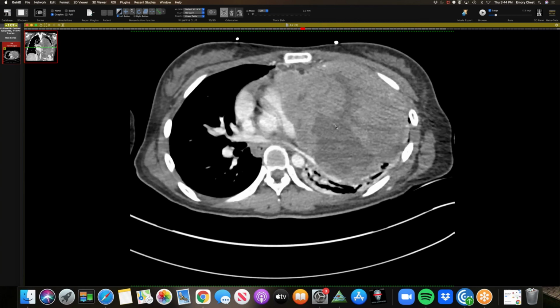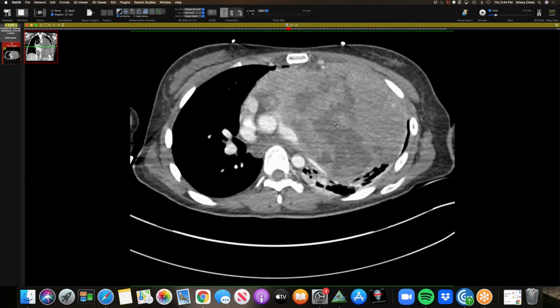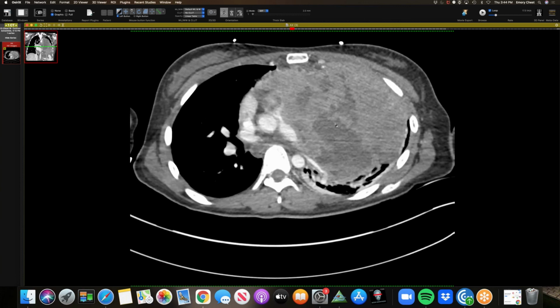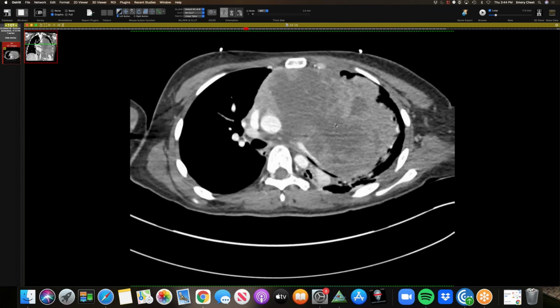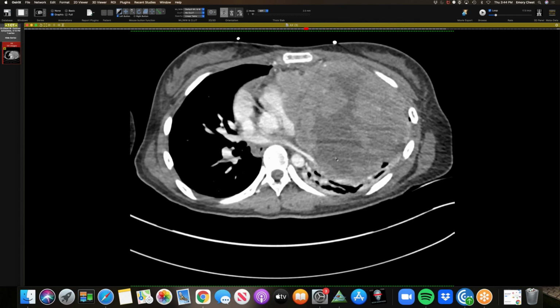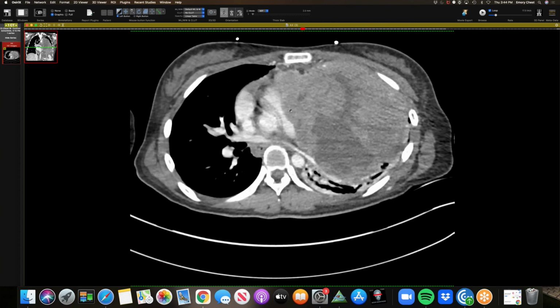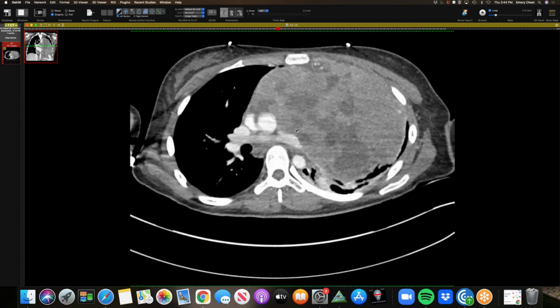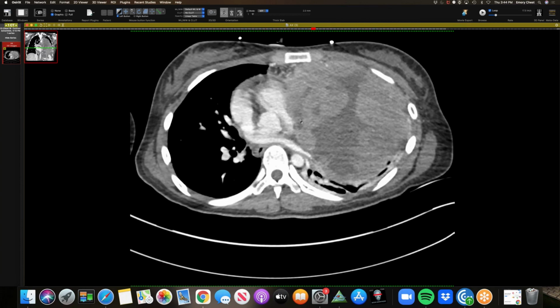Yeah, so mediastinal B-cell lymphoma happens in 30 to 40-year-olds. It looks like a non-Hodgkin's, but it's usually in that 30 to 40 range. So she's a little young for it, but yeah, they have a good response. But that's a big one. And really severe compression here with the RVOT. I thought this was kind of pretty severe there.